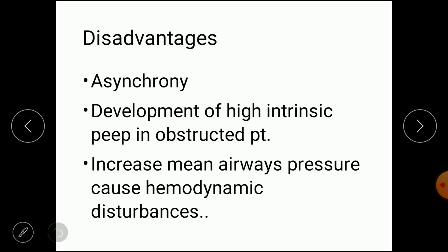Next, we talk about the disadvantage of this assist control mode, that is asynchrony. In this also, asynchrony is present, because the patient just initiates the breath. After that, the machine provides the tidal volume. So there is asynchrony with the patient's breathing, then development of high intrinsic PEEP in obstructed patients.